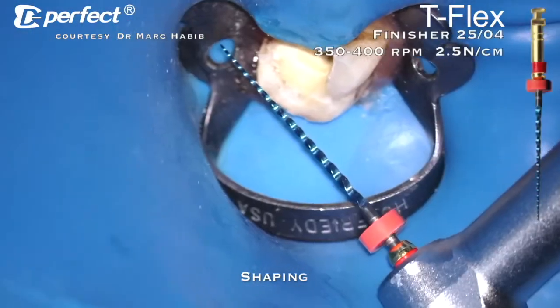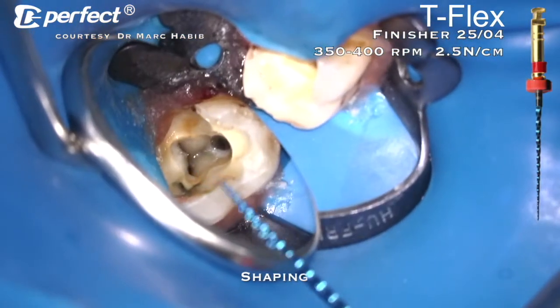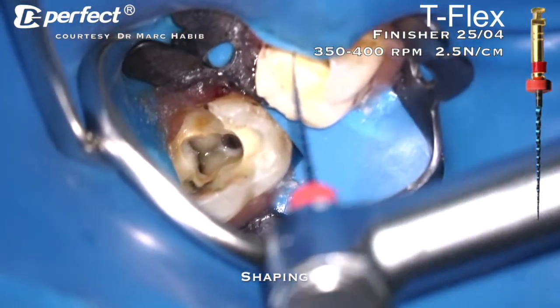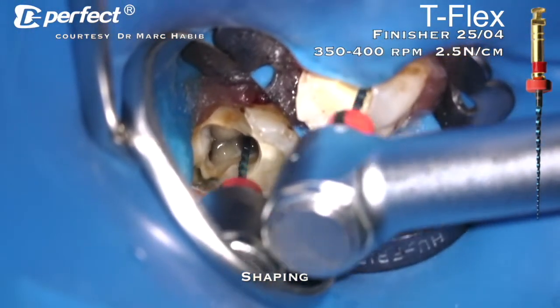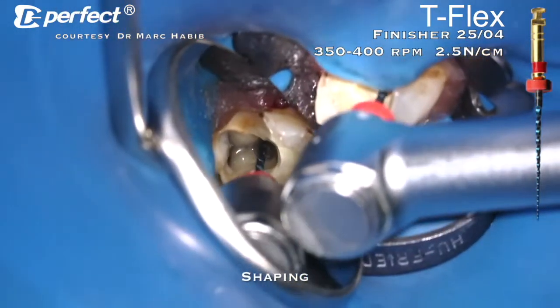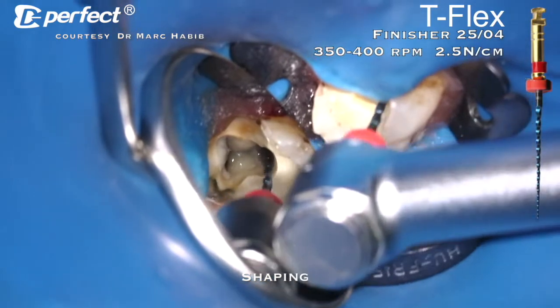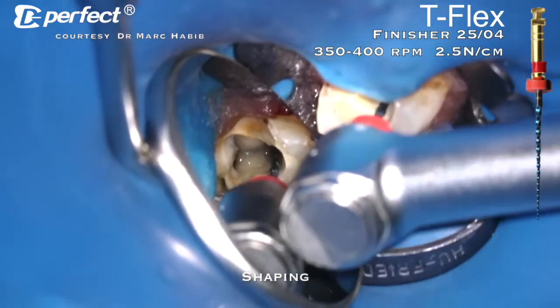Then we move to the Finisher, the 25 tip, 4% taper. This is the second file from the Finishers of the T-Flex. We prepare the distal canal. You can see it's already very large, the distal canal.